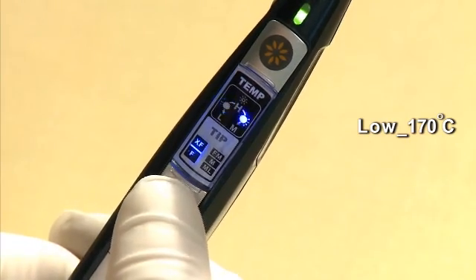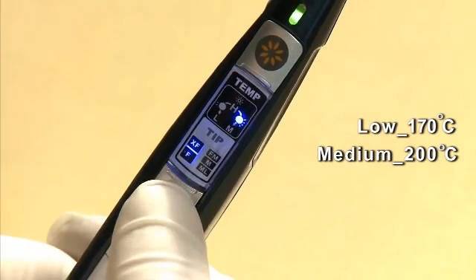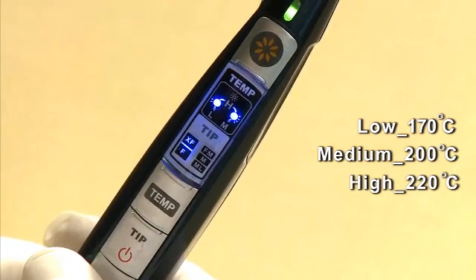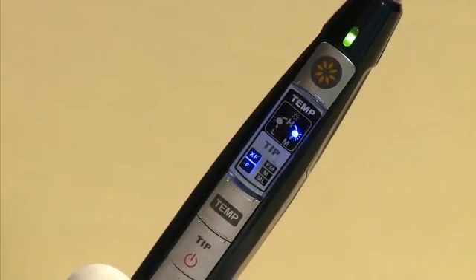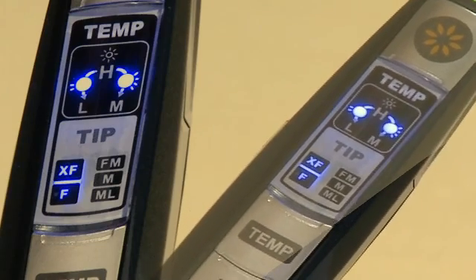The medium setting has a temperature of 200 degrees Celsius and the high setting has a temperature of 220 degrees Celsius. Pressing once will change the temperature to the high setting and both the L and M indicators will light up.